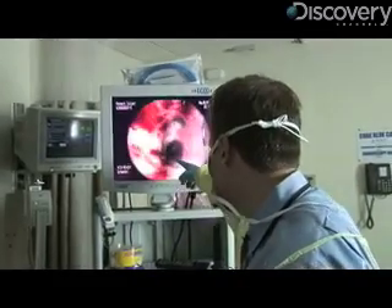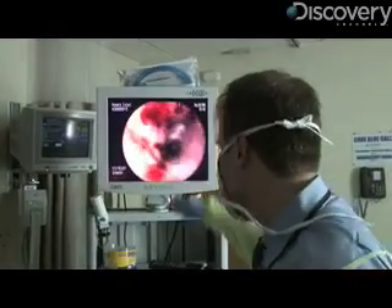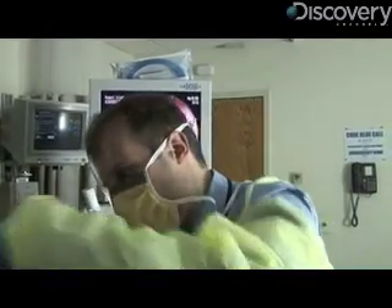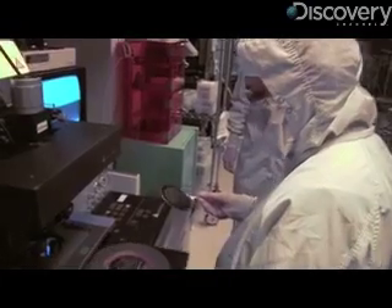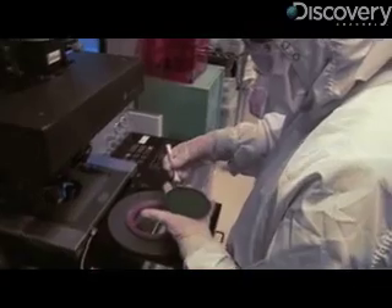What the doctors really want is an endoscope they can use to go in and know instantly — that's cancer or that's pre-cancerous growth — and then they can immediately remove it. Bernstein and his team aren't making the entire endoscope; they're just making the very tip.